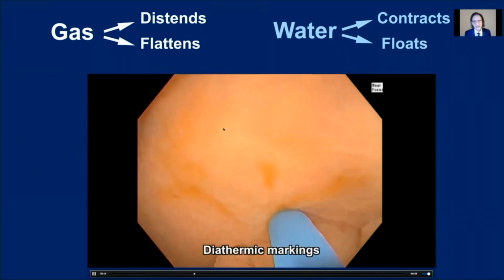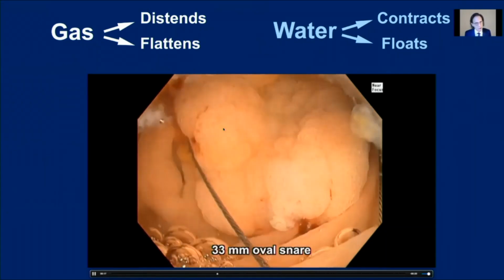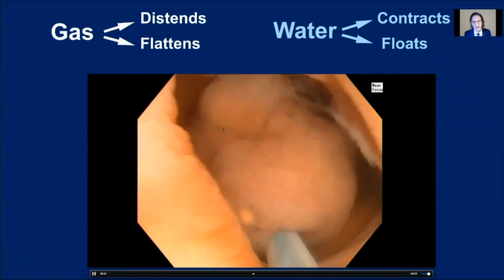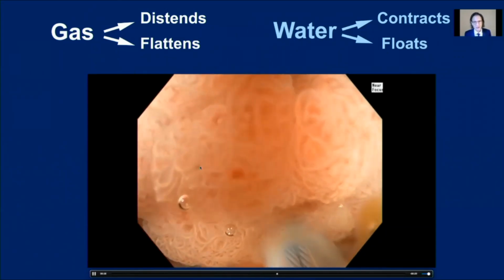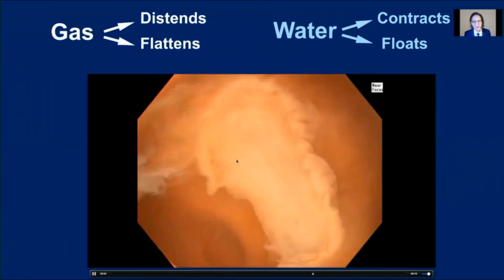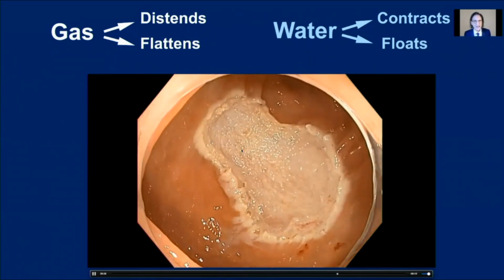Now I'm placing some diathermic markings around the perimeter to ensure that I can get my snare around the entire lesion. And after I've completely encircled the lesion with this 33 millimeter snare, we apply our current, we resect, and the resection plane is in SM2.